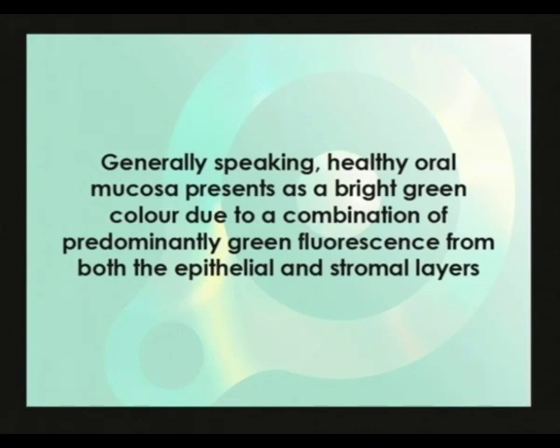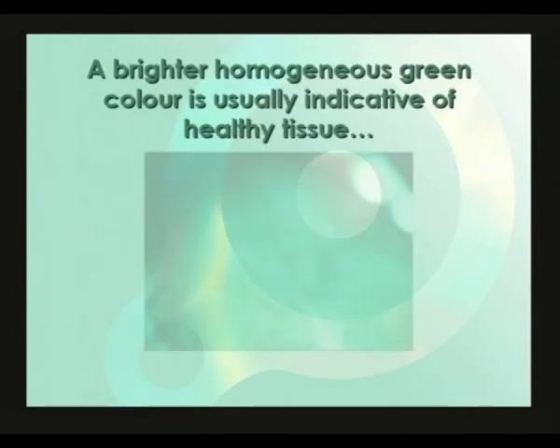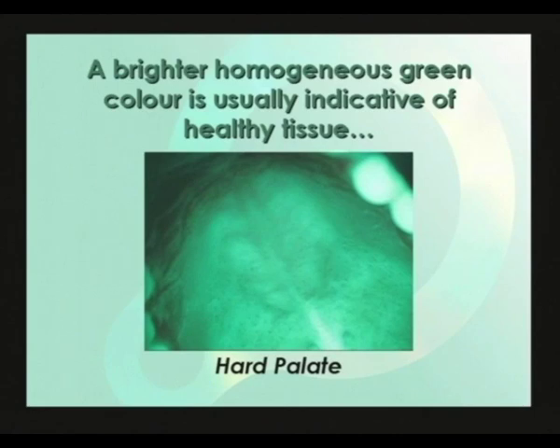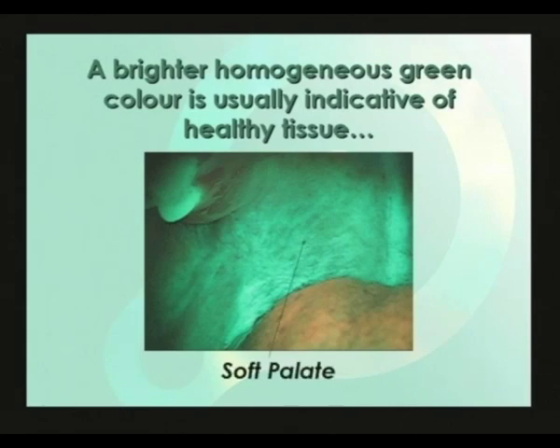Generally speaking, healthy oral mucosa presents as a bright green color due to a combination of predominantly green fluorescence from both the epithelial and stromal layers. Here we see the hard palate, which shows, generally speaking, as a broad expanse of green. The soft palate is also generally green. The darker areas around the borders of the image are from shadowing due to the way the blue light has been directed at the tissue.